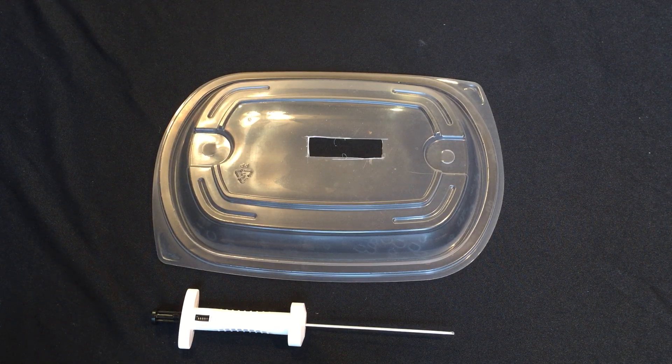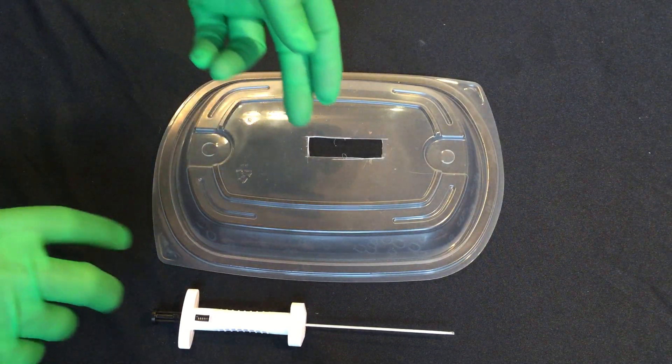Sometimes you're going to have to close a trocar site that's been enlarged because the surgeons had to take out an organ or remove the port. For whatever reason the incision is enlarged and he wants to use a closure device like the Carter Thomason or the WECC, but he can't do that for the first one — he's going to have to freehand it. Because the incision is too large, putting the cone or the WECC device in it would cause it to leak and it won't keep the pneumo, so it'd be dangerous against the organs beneath.